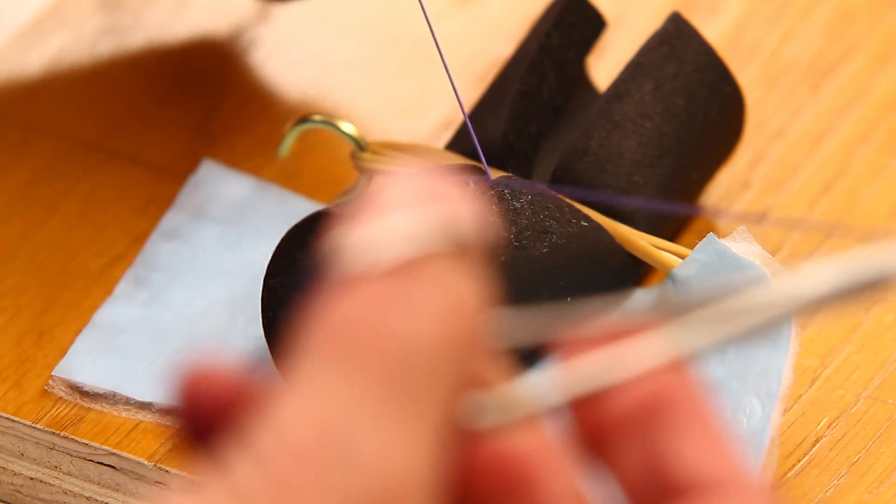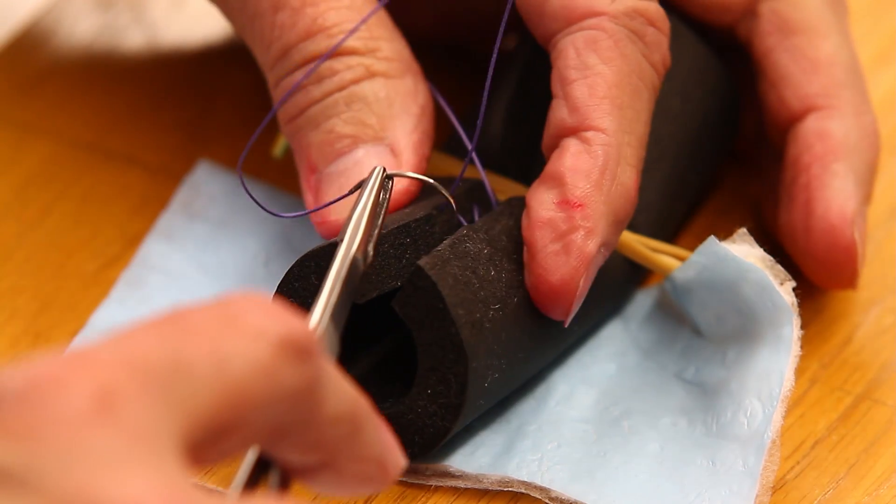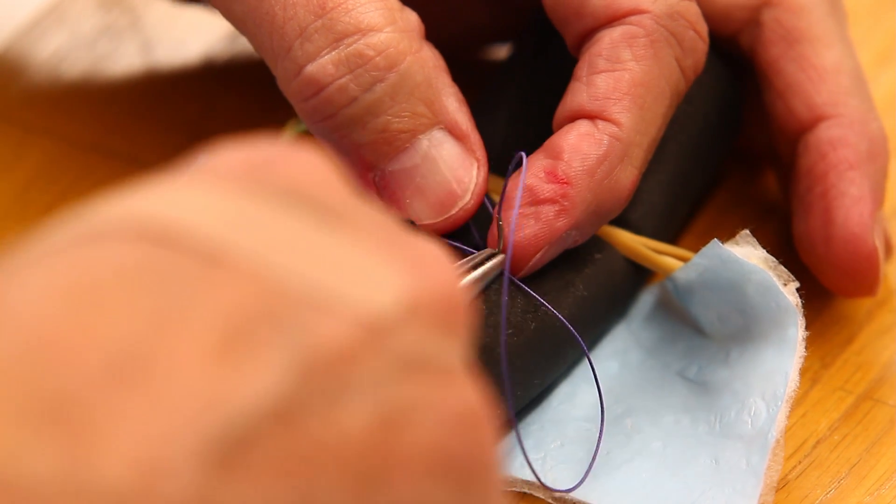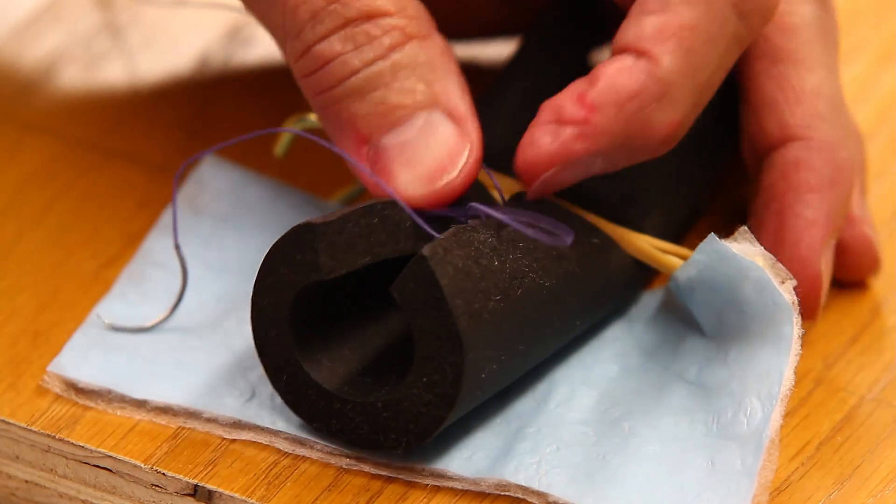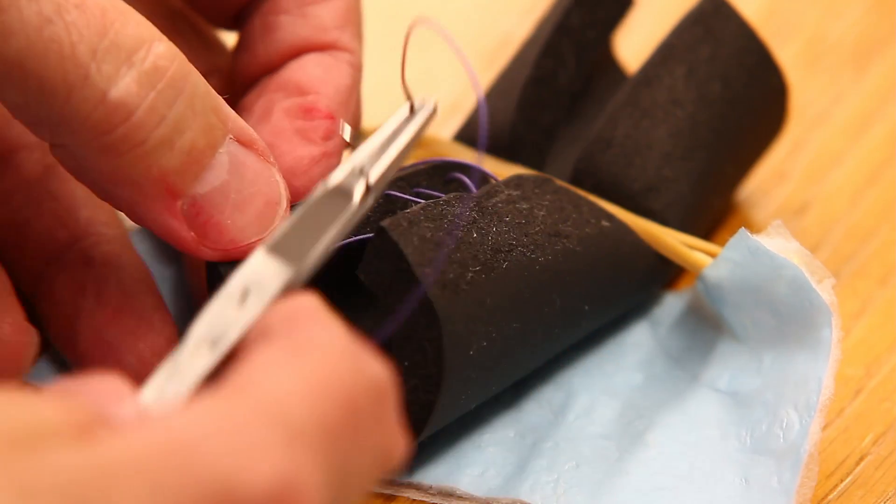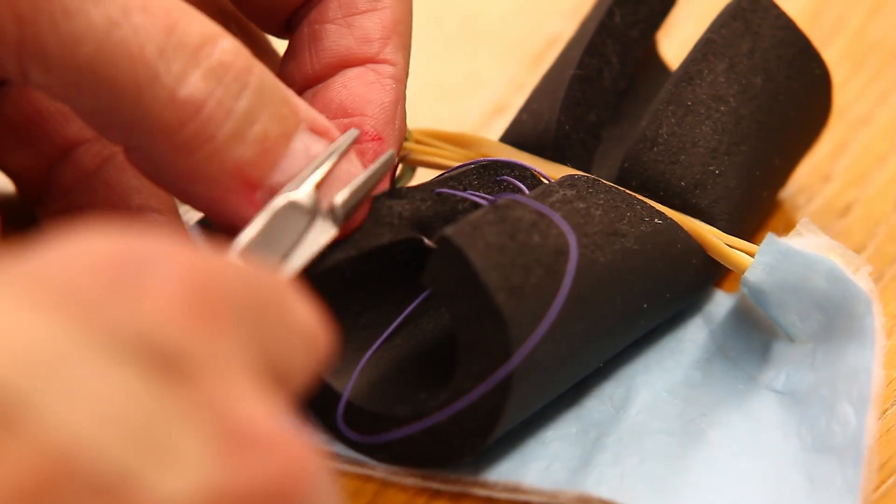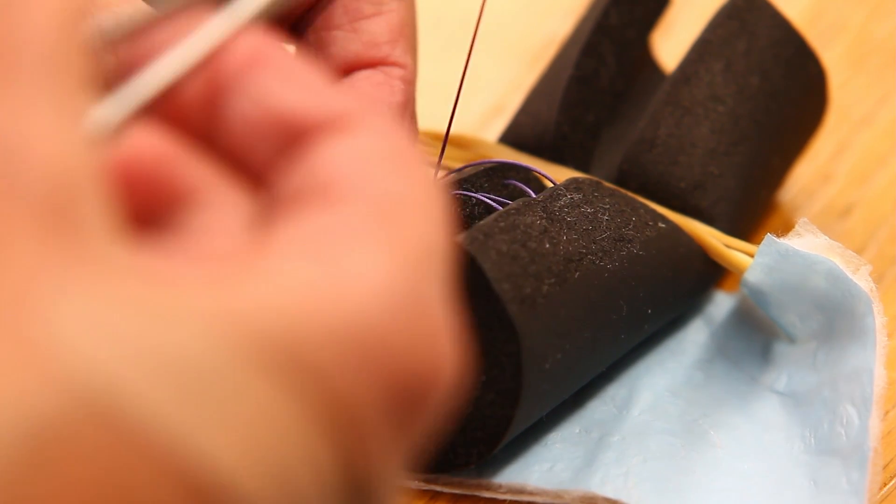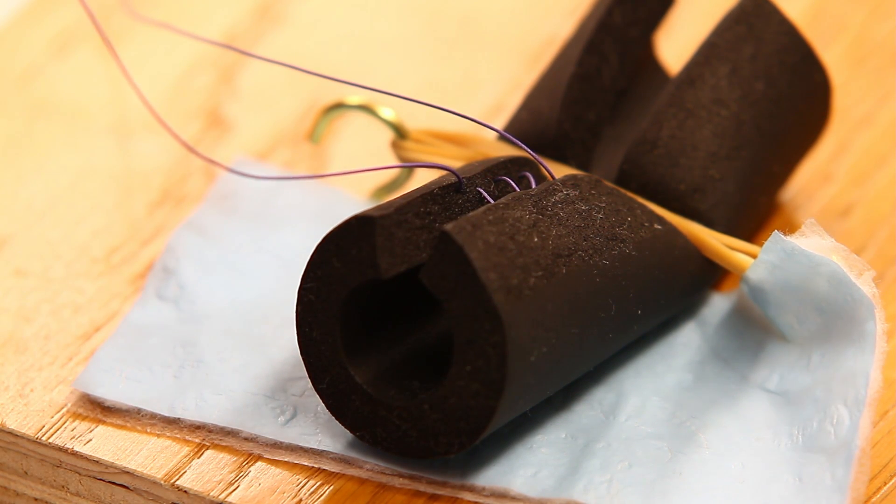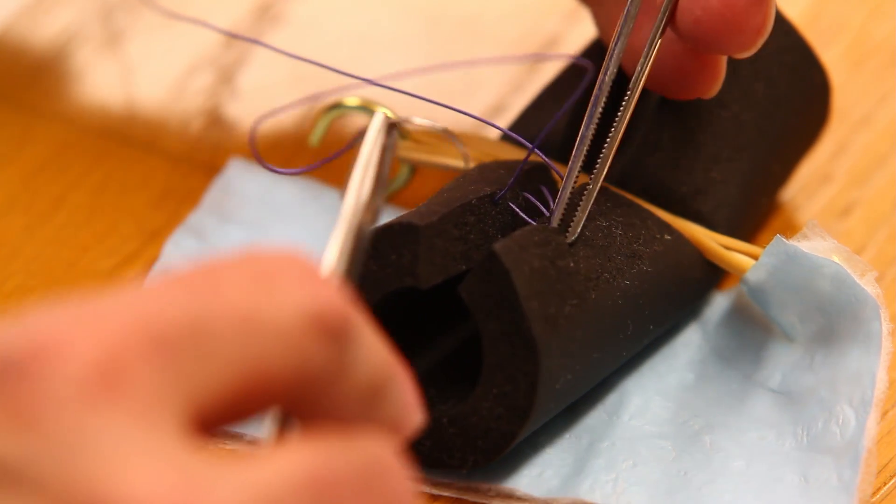And you can gently pull this together as you go because you can't drag it at the end. I find in these kind of delicate repairs often your hand works better than forceps. Sometimes you need to use thumb forceps to reach, but often your hand is the most effective retractor.